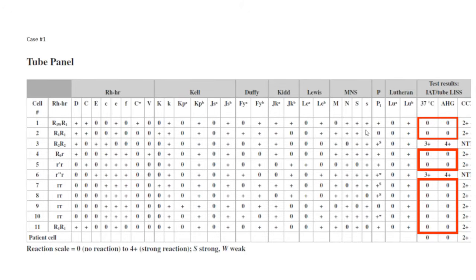You would need to exclude on what we call homozygous expression, as in here cell number 8, which is showing homozygous expression of big S, but negative reacting. So you could rule it out based on that cell there. While in cell number 9, you have correspondingly little s homozygous expression because there's no big S, and you can exclude little s based on that cell.